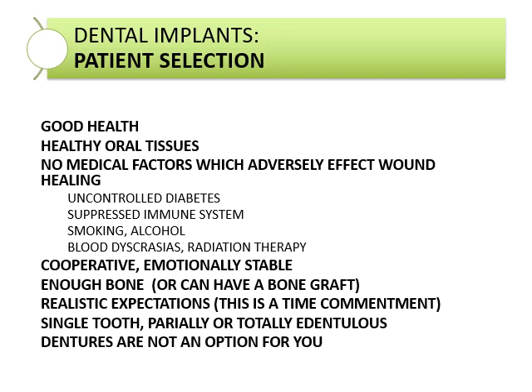Definitely have to look at x-rays to see if there's enough bone that can support the fixture or the implant, and what the overall health of the patient is and what their needs are. Is it a single implant or partial or totally edentulous patient? So it just depends on the overall health of the patient, and is there enough bone there to support the type of loading that's going to be happening on the mandible or even in the maxilla.